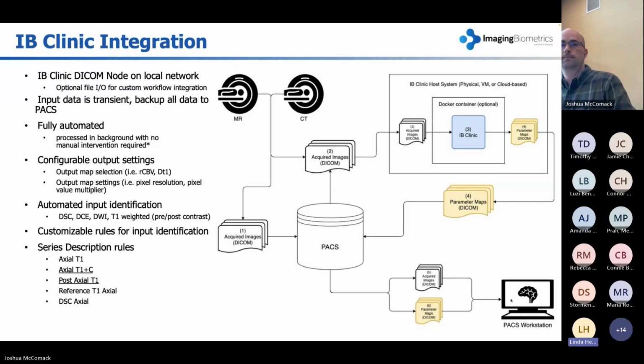Great, thank you. One more question. When the maps are generated, I'm guessing they appear as a radiologist brings up a patient and does his dictation. These are all with each exam and can be retrieved repeatedly?